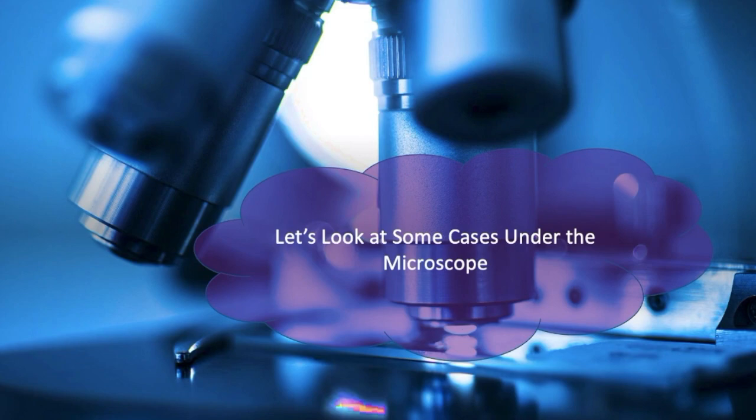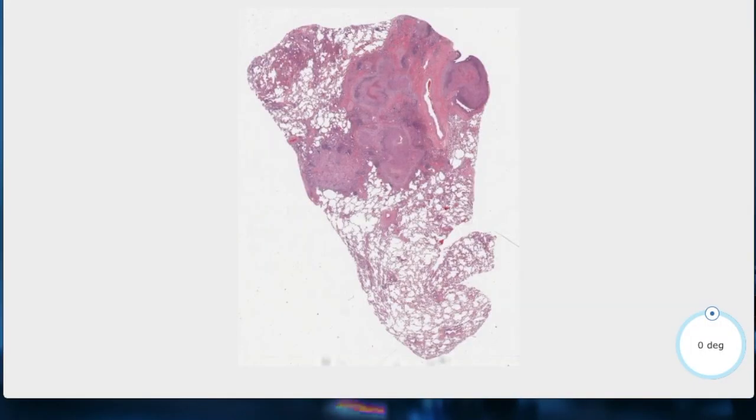So we finish the chapter, and let's see some examples under the microscope. And I want to acknowledge Path Presenter, an awesome website for teaching and for presentations. Very good. They have tons of cases you can see on each pathology. So I encourage you to go and sign up for this website and learn more. So let's see some examples from the collection of Path Presenter.